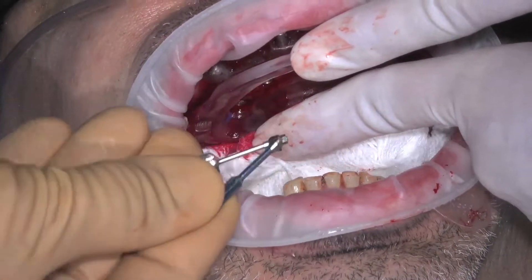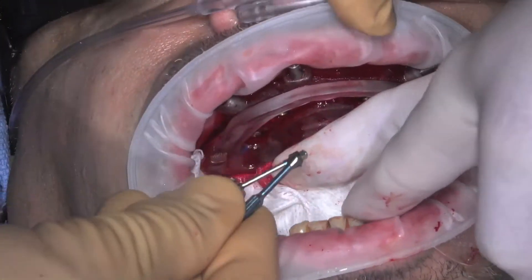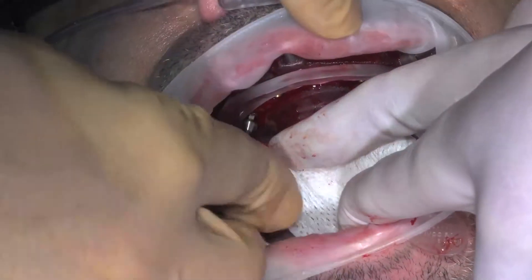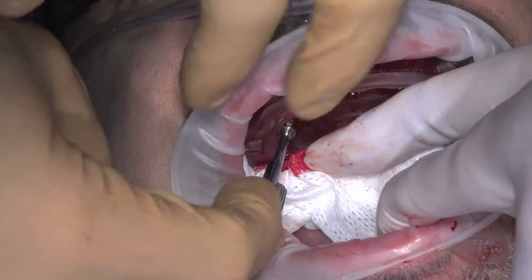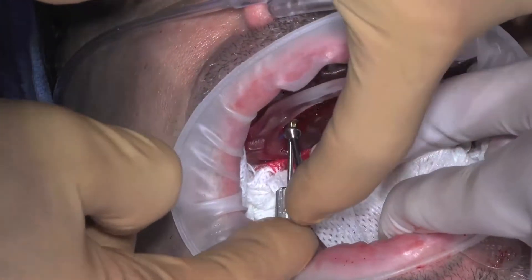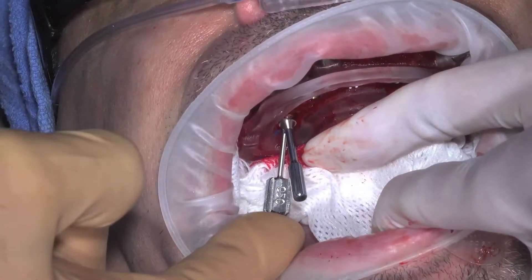Based upon the implant manufacturer, a carrier for the angled multi-unit abutment may be provided by the N-Sequence lab, or you may need to purchase them from the implant manufacturer. Insert the hex driver into the abutment screw and the carrier screws into the top of the multi-unit abutment. Align the multi-unit abutment screw toward the blue line on the angle rotation guide.